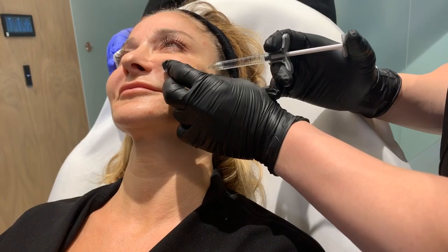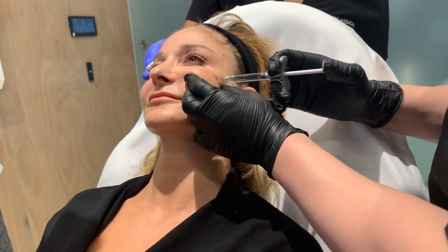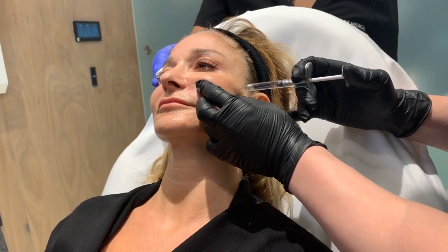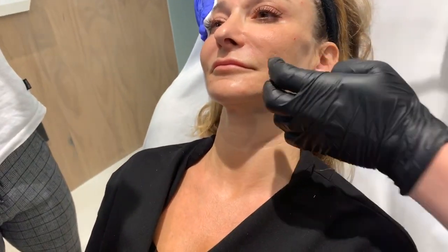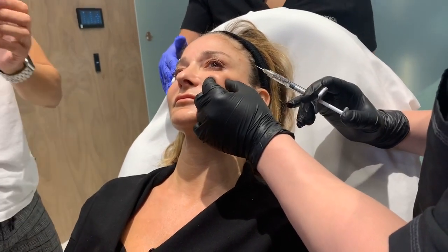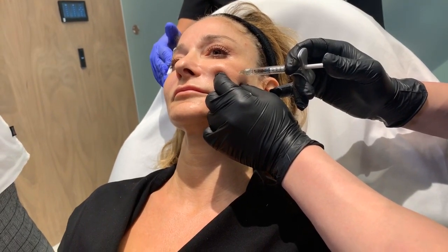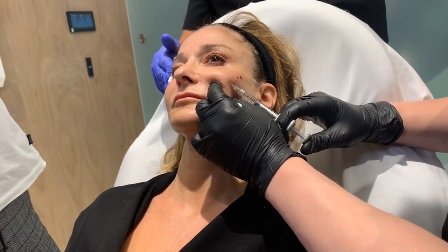And we're gonna lift. We're gonna just lift. Let's get a little lateral contour. Let's focus on giving her some definition. And the thing is, she already has a nice size. We don't want to increase the size too much. We just want contouring. This is where women put their makeup on. They look hotter. They look better. So we're lifting, okay? Now with her apple of the cheek, her cheekbone is a little high here. So we're gonna go in and blend that to her mid-face, right there, and also the submalar area, because this will blend it properly.